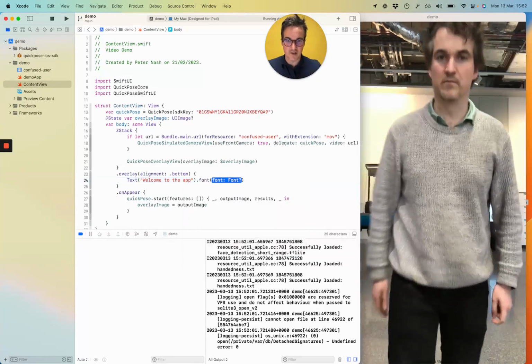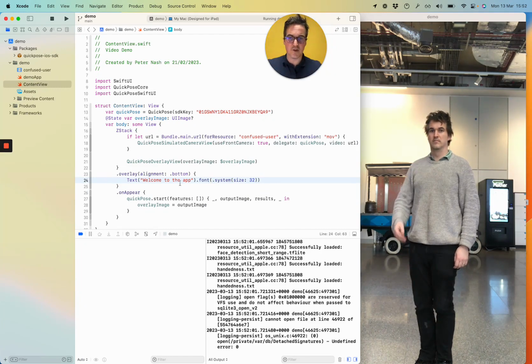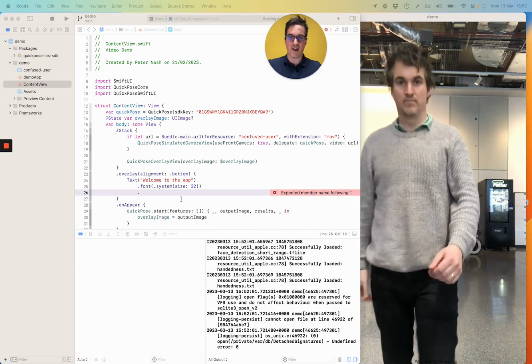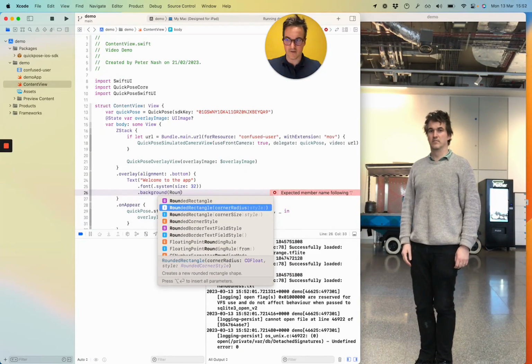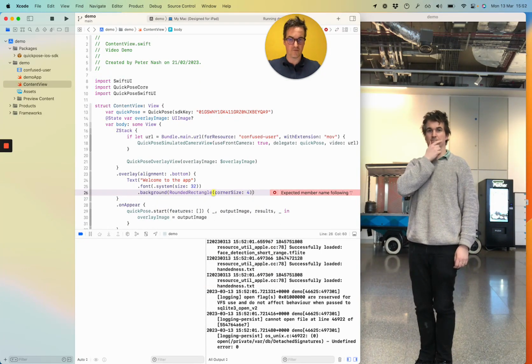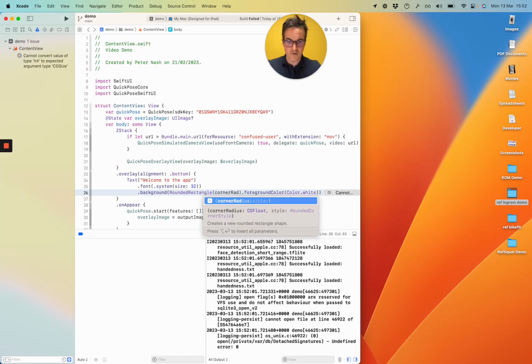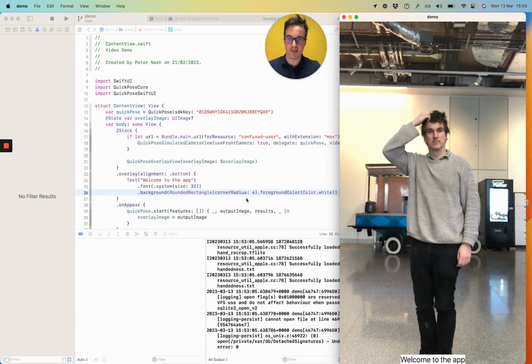I love a large font size for these sorts of things, and I'm going to use the system size 32. I've got some sort of styling in mind for this, so I'm just going to plow ahead with that. We need a sort of a background rectangle for this to really pop. I'm going to use a rounded rectangle, just gives us a few options later on. Got a corner size of 4, great. And I'm going to make it a white box behind the black text. Ooh, what have I done? Corner size. Oh yes, corner radius. Welcome to the app. Okay, so we need some padding around the side.